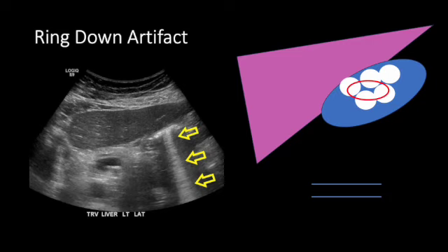There's a lot of impedance between those two structures, those two tissue types. And so when we get ultrasound beams that come down into this area, into this pocket of fluid, they get highly, highly, highly reflected inside, with only a little bit of that energy being transmitted back down to the deeper structures or up to the machines.